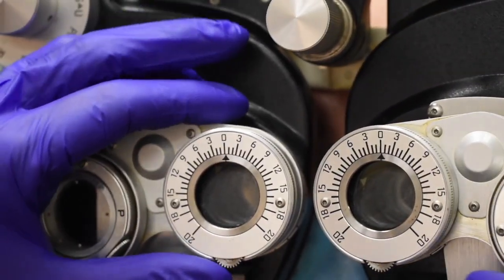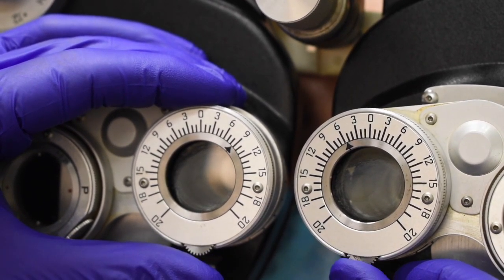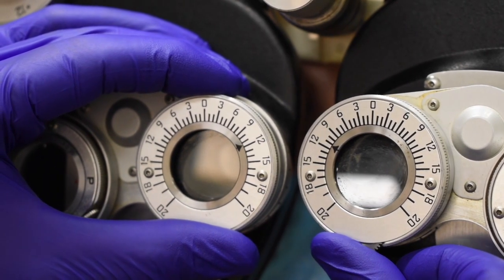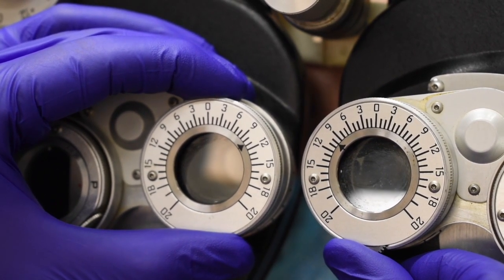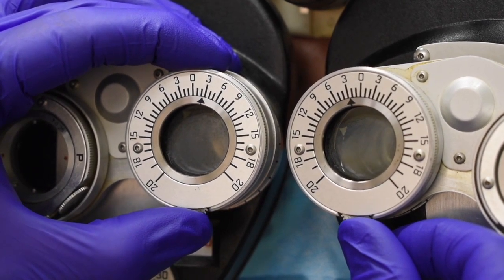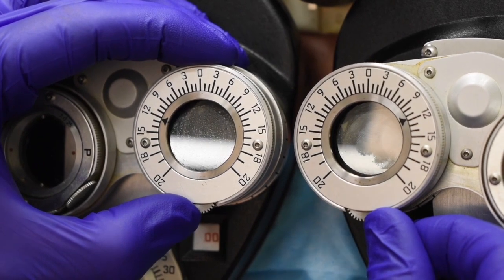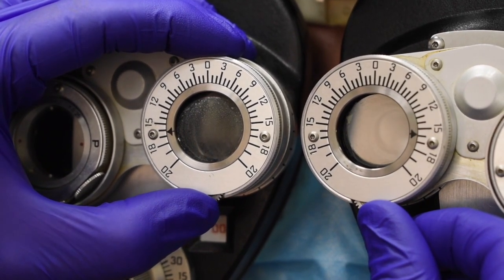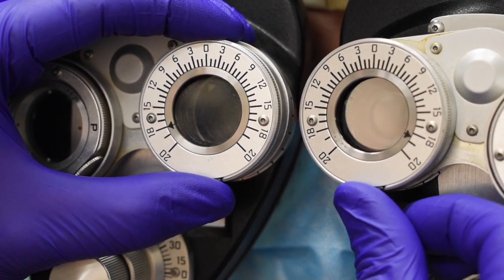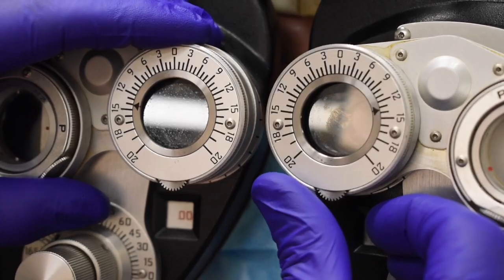Now we'll set her up. And tell me when you see either blurry or the letters split into 2. Again, doing base in first. Blur. So here we have 15. When you see 2. Two. 15/22. And when you see 1 again. One. 18. 15/22/18. And tell me when they go blurry again or double. Blur. And when you see 2. Two. So I've got 23, 34, and when you see 1 again. One. 23, 34, 28.